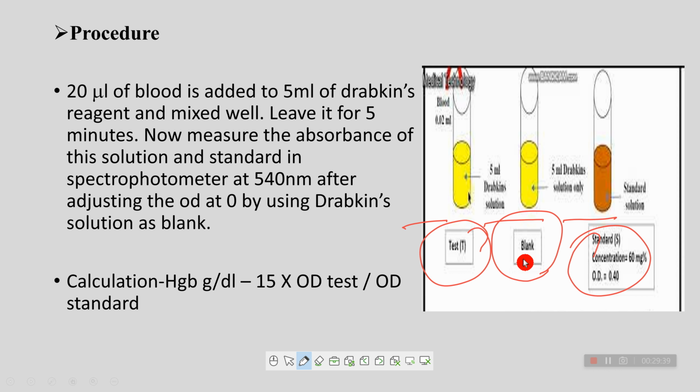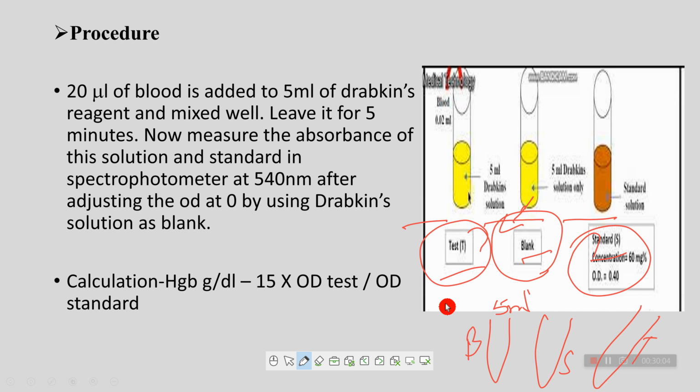Alright, we need 3 test tubes labeled as blank, standard and test.